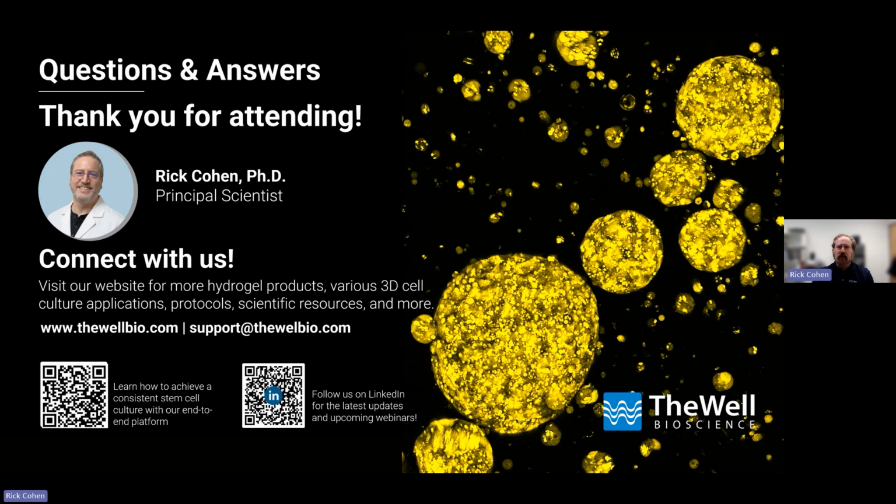So Matrigel, which is an animal product, has probably thousands of other chemicals in it, or not small molecules, but proteins, ECM. So it's very hard for me to predict, but those hydrogels would be very different. I think the amount of Matrigel you would need to get a 3D hydrogel would be much more, and I'm not sure how iPS cells would grow in a 3D Matrigel matrix set up in the same manner that we have.